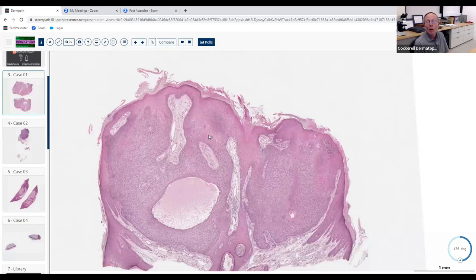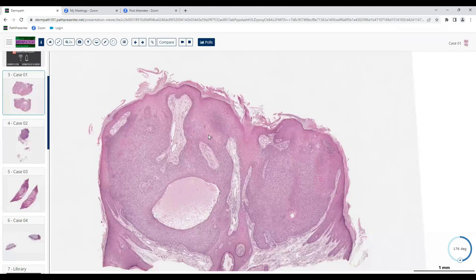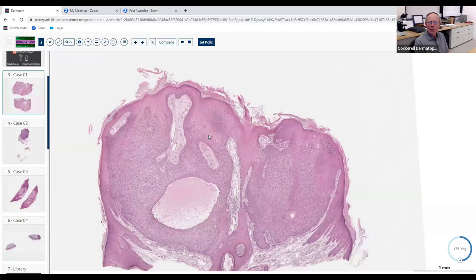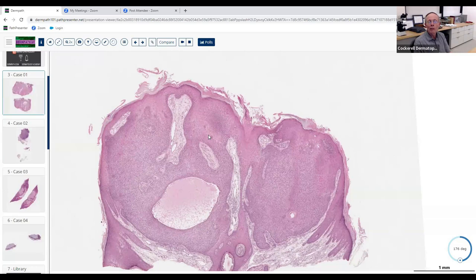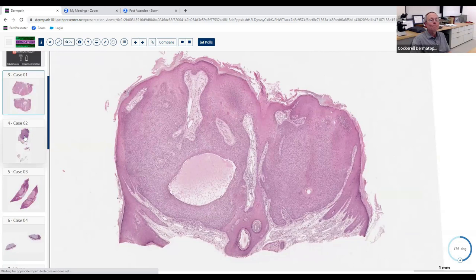On the board examination they could ask a second-order question regarding this entity. Multiple trichilemmomas are associated with Cowden syndrome. They do like to ask things like that — they might show you this, expect you to get the diagnosis quickly, then ask what syndrome is associated with it, and sometimes even ask what gene has been implicated. So make sure you know that.